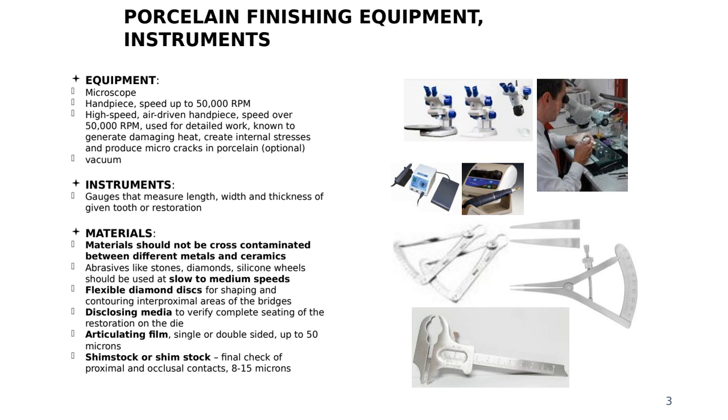In terms of the high speed, we have to be very careful with the burrs that we use. Make sure that the burrs you're using are good burrs, that they cut really well. And also check whether your manufacturer recommends using high speed.